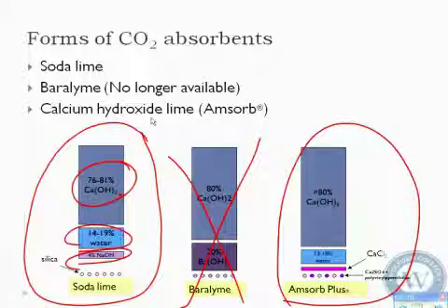They have to have water present for this reaction to occur because it starts out with water plus carbon dioxide, which forms carbonic acid. So you have to have it to begin the reaction.